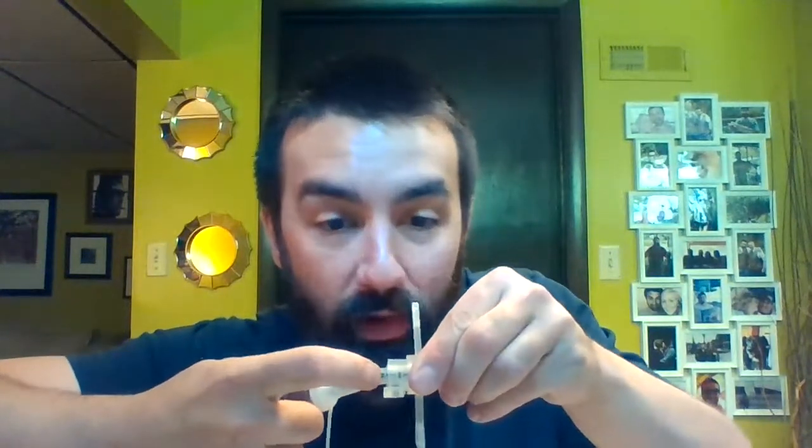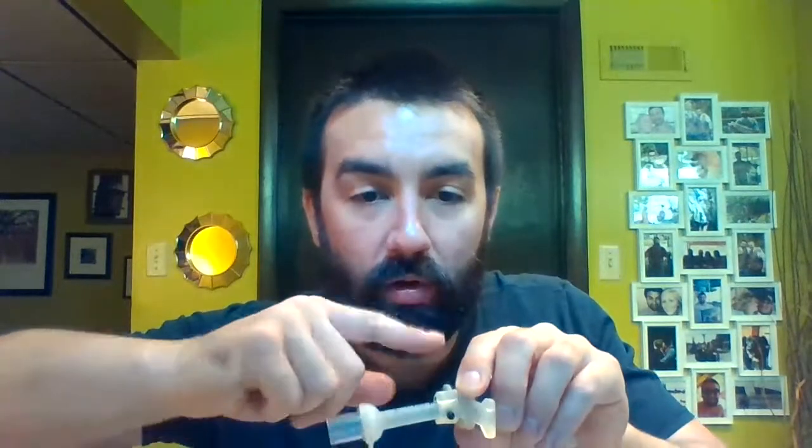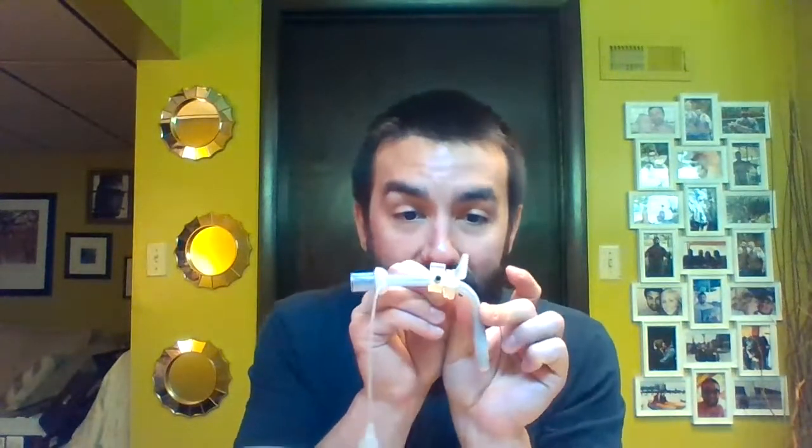So I'm going to advance this thing to 10. Okay, you need to pull and lock that flange in. And then just like with any regular airway, we're checking depth. So as a part of your routine assessment, you'd say, okay, we're 10 at the flange here, and we're measuring right where that little buckle goes around it, okay? So it's important to remember that that thing needs to be locked, and that we're confirming placement, okay? So you can see that would give us an extra length.